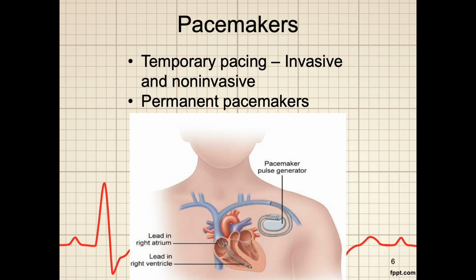Pacemakers can be temporary or permanent. Temporary pacing can be invasive or non-invasive, and permanent pacemakers are pacemakers that are tucked into the body and that have a long-lasting battery so that they can be left in the patient for prolonged periods of time. They can be programmed remotely through various methods, including electronics and magnetism.